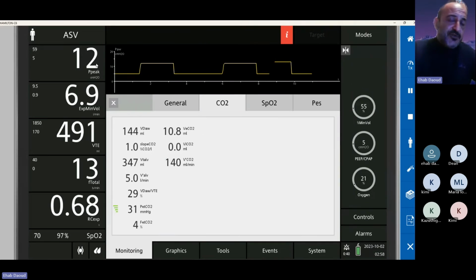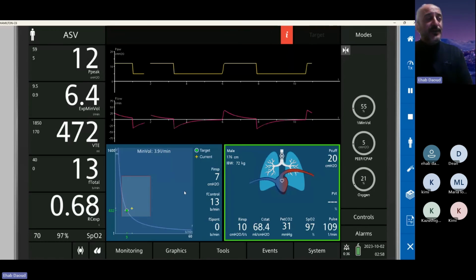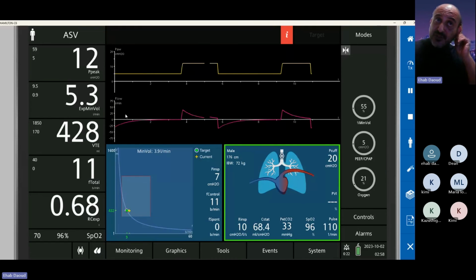And once you're at 7/5 or 5/5 and the patient's still doing good, you don't need to switch the patient to pressure support, especially if the patient is triggering all the breaths. So if you find here the patient is breathing on his own, like 15, 20, and the inspiratory pressure is so low, actually that's your spontaneous breathing trial.